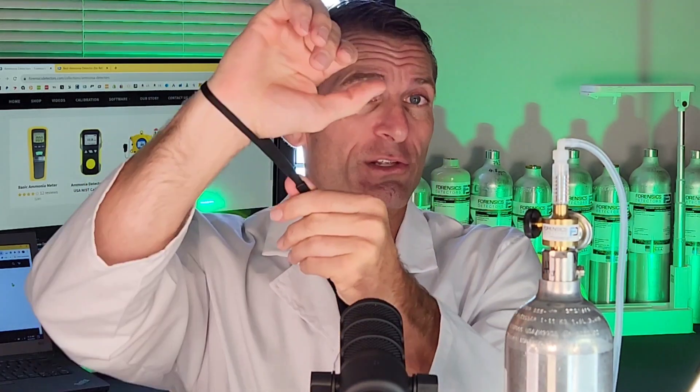It also comes with a sling so you can pop it on your wrist for wrist holding. It comes with a nice color manual, very nice indeed. And it also comes with a NIST calibration certificate to make sure you are comfortable with its accuracy, operation, and quality control.